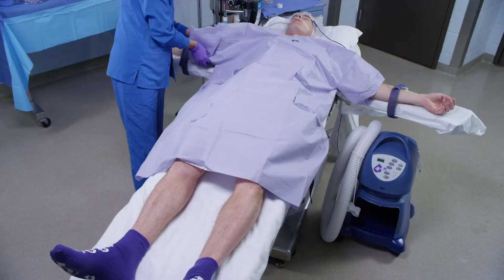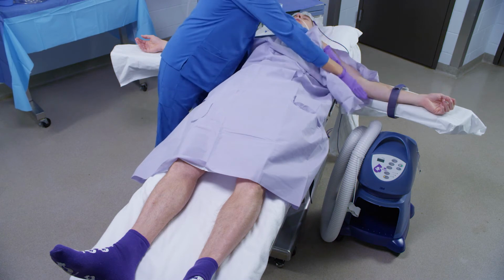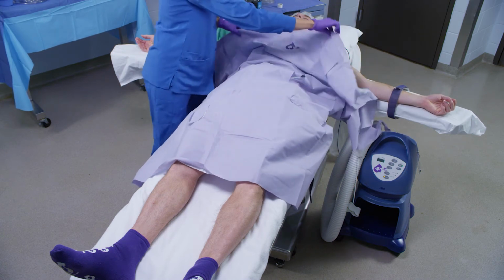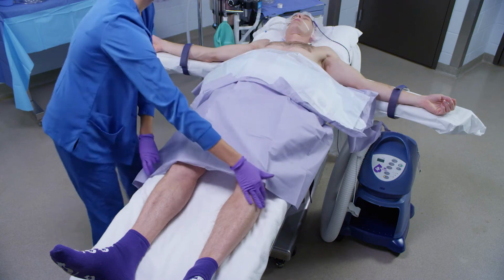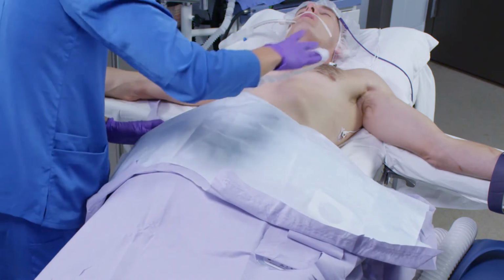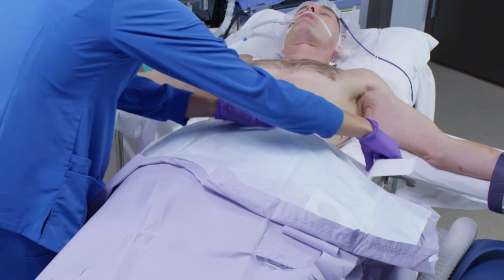For torso or lower body warming with the 3M Bair Hugger Flex warming gown, unfasten the fastener strips of the 3M Bair Hugger gown sleeves. Fold over the upper body insert and slide the entire gown down on the patient. Remove the backing from the patient adhesive strip located on the upper body insert and adhere to the patient.